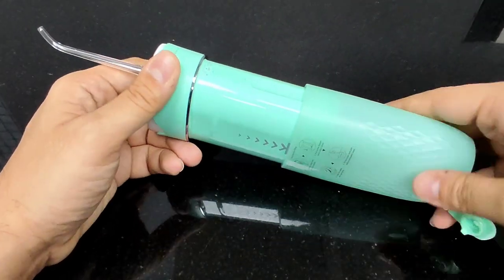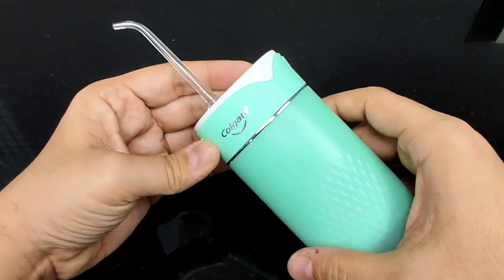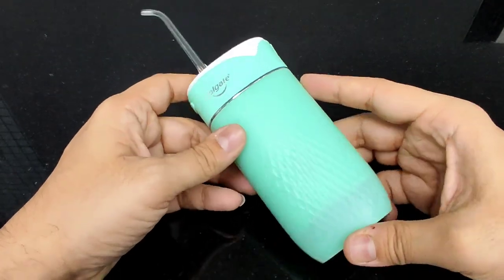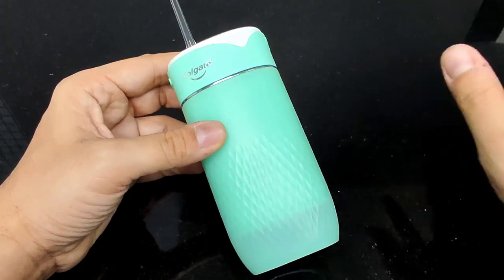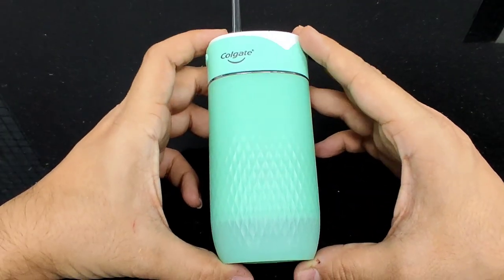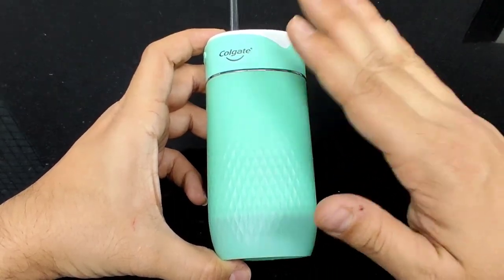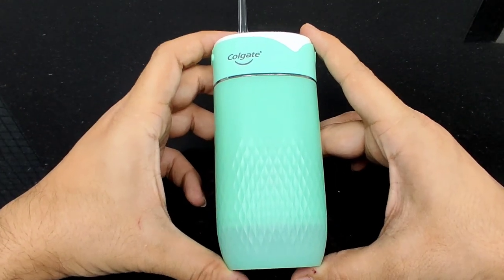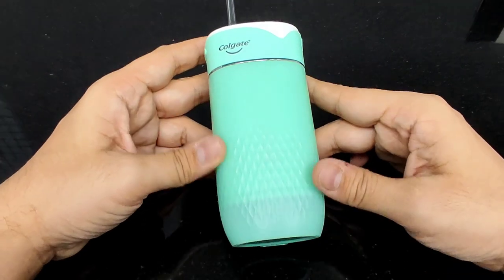Colgate claims that one full charge of about four hours will last you a solid four weeks — so you won't need to worry about the battery running out when you're on the move. Four weeks of use from a single full charge is excellent. The body also comes with a two-year warranty.